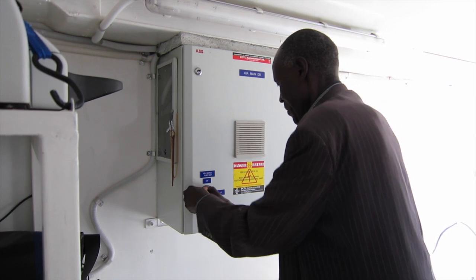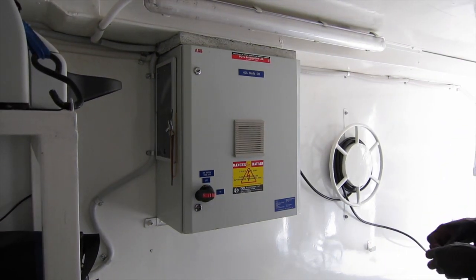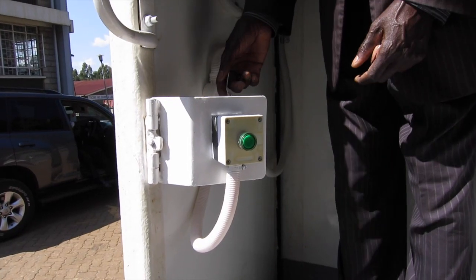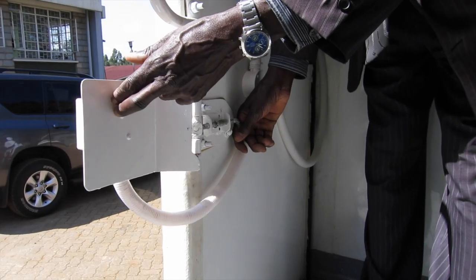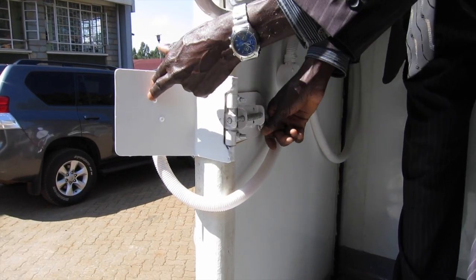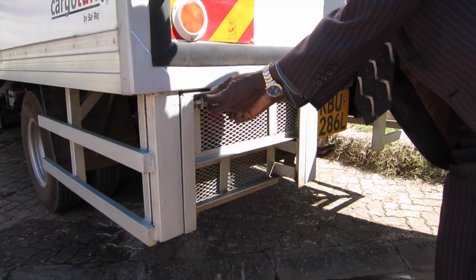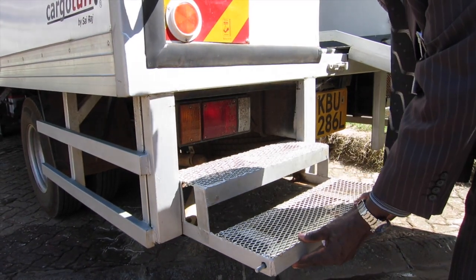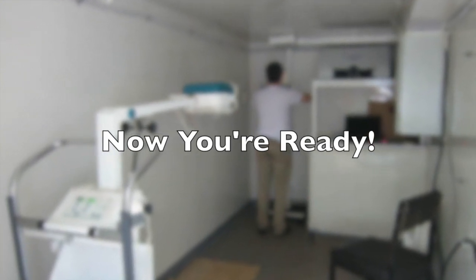Next, turn on the breaker inside of the truck. You should see the light inside of the truck light up. Move the heater button into the operating position, and also move the step for the radiographer into the operating position. And now you're ready to start taking x-rays. Thank you.